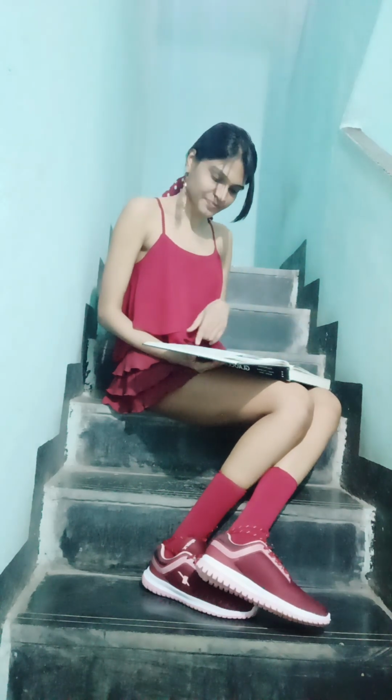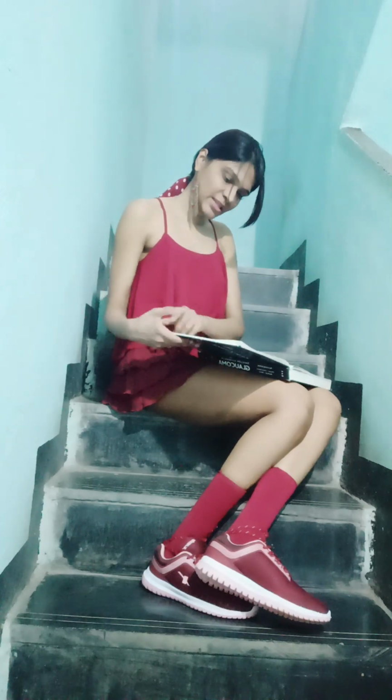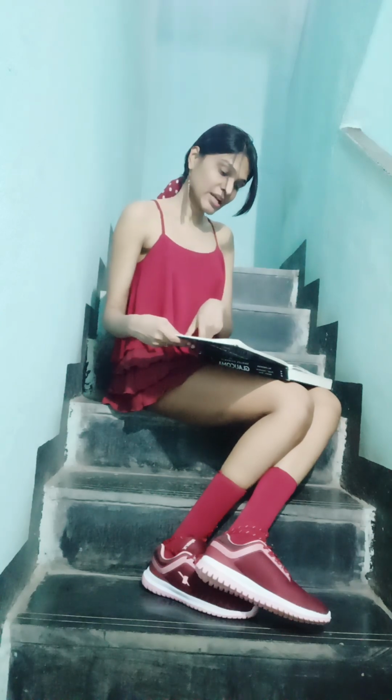We can see only the cornea, then the anterior chamber angle, and the central portion of the lens with the anterior segment OCT. But ultrasound biomicroscopy, between 20 to 50 megahertz, will give us the details of the ciliary body, the tumors behind the root of the iris, and the ciliary body details, ciliary body pathology. In that sense, ultrasound biomicroscopy has more advantages over the anterior segment OCT, but anterior segment OCT has a better resolution than ultrasound biomicroscopy.